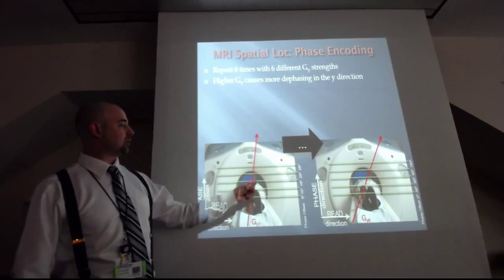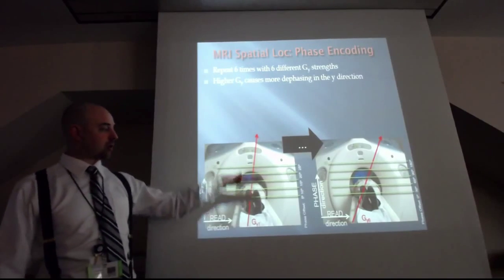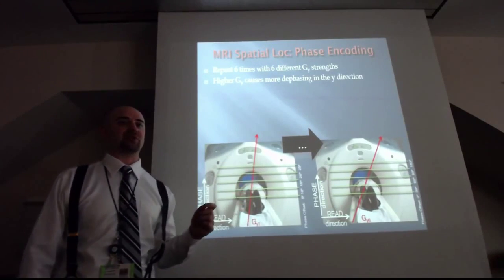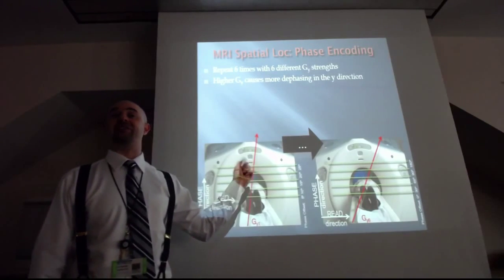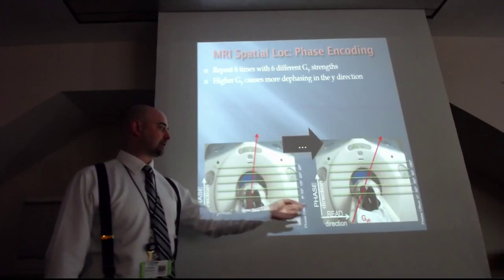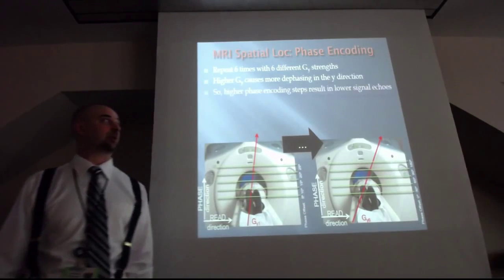Notice that if you turn this on and turn it off, along the y direction, they're still going to be all rotating at 64 megahertz. But during that time that was on, right, the ones that were rotating or precessing faster gained phase on the ones that were lower down. So after it's been on and turned off, you've gained a phase offset, say 5, 10, 15, 20 degrees.